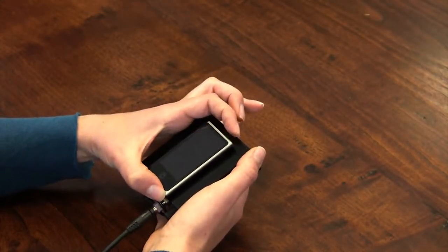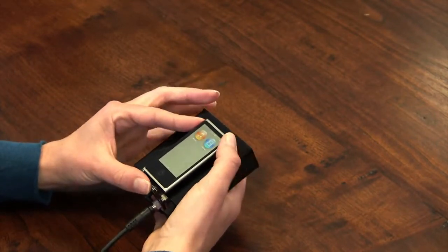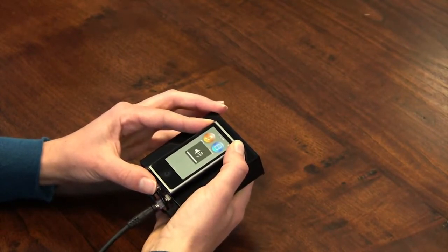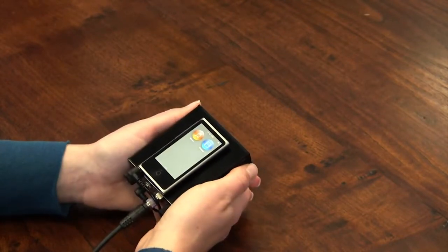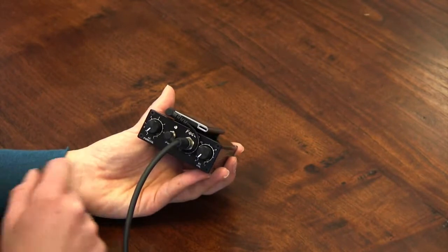Turn on the iPod by pressing the button on the top right. Use the volume control on the left side of the iPod to turn the volume all the way up. The iPod volume should always be left at maximum because you use the amplifier to control the volume that you hear through the headphones. Now we'll test that our headphones are working properly.